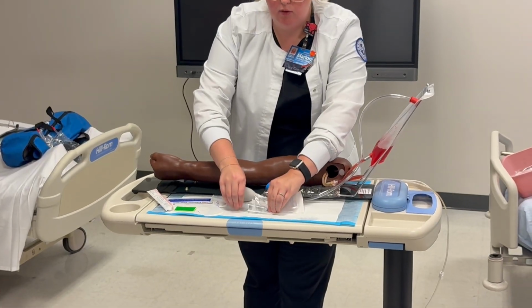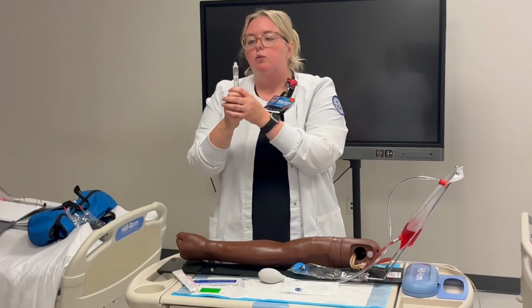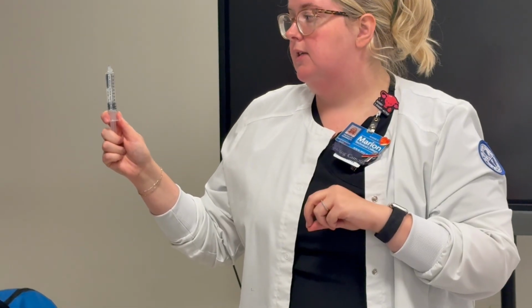Another important thing, when you have this, is not part of the skill, I'm just showing you. When you open a saline flush, there's always a little bit of air at the top. When you open, you want to try to get that air out. That's in real life. We refill them here in the lab, so they won't always have air in them, but be conscious of your air, okay? So you want to prime it by pushing some fluid out. Does that make sense? Okay.